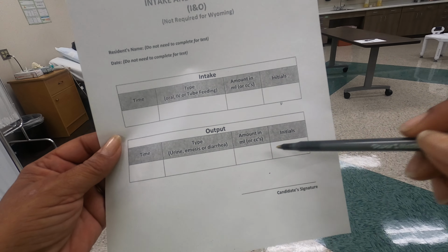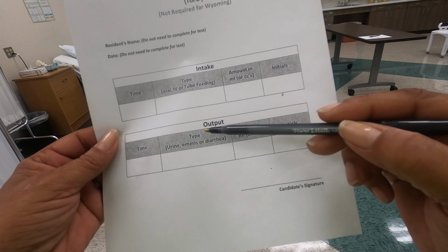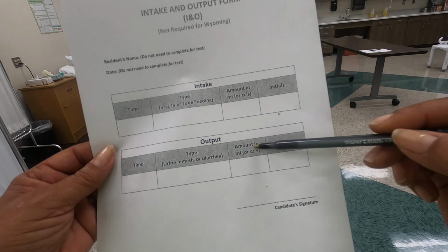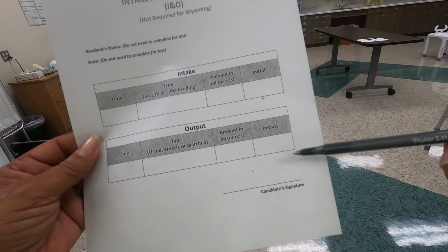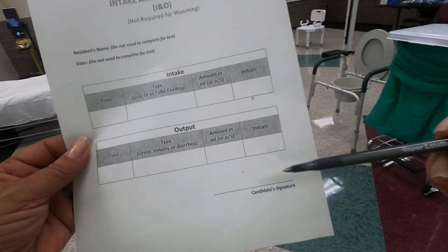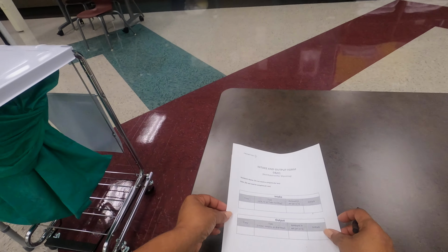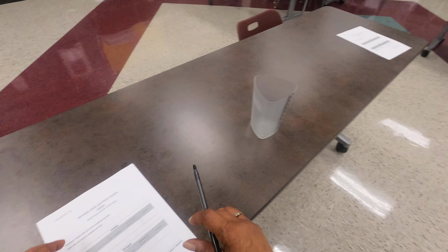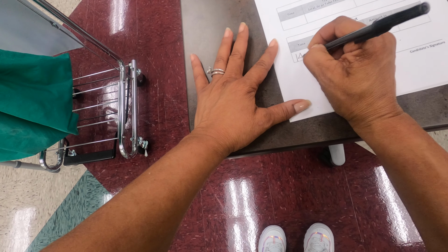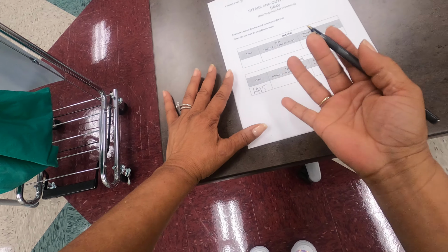You see there's 4 columns. You have a column for time, a column for the type of substance that you measured, the amount, and then your initials, and then underneath you have a line for a signature. So you want to make sure you fill in all tables and the signature line. So right now it's 2:15, so I'm going to put 14:15. That's military time.